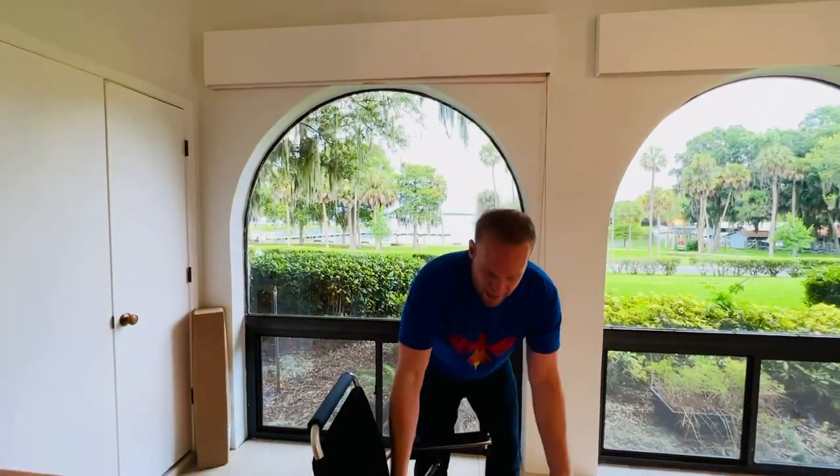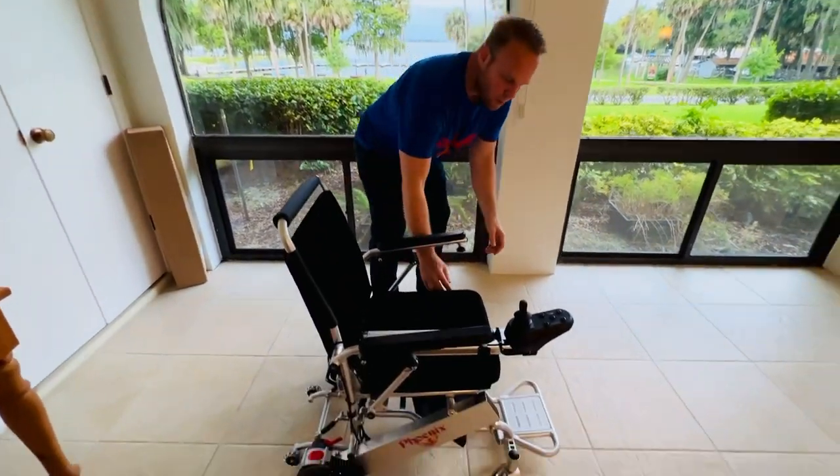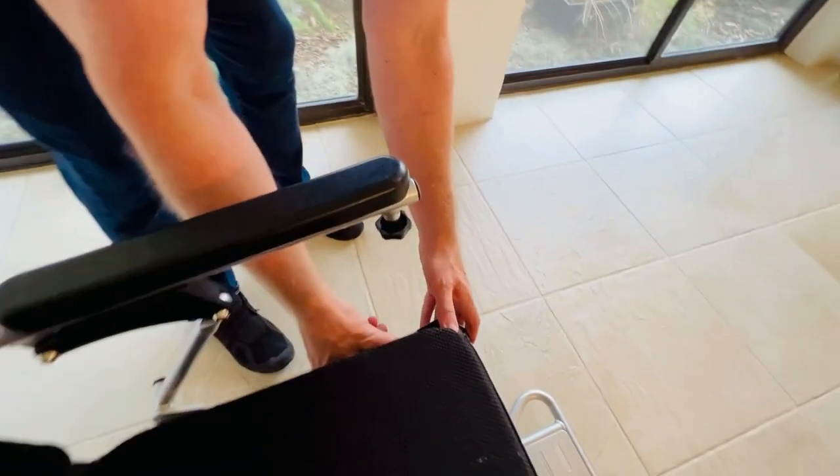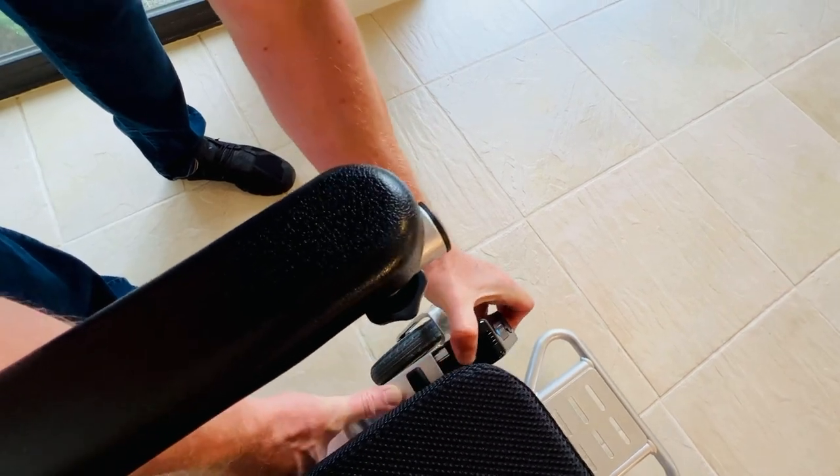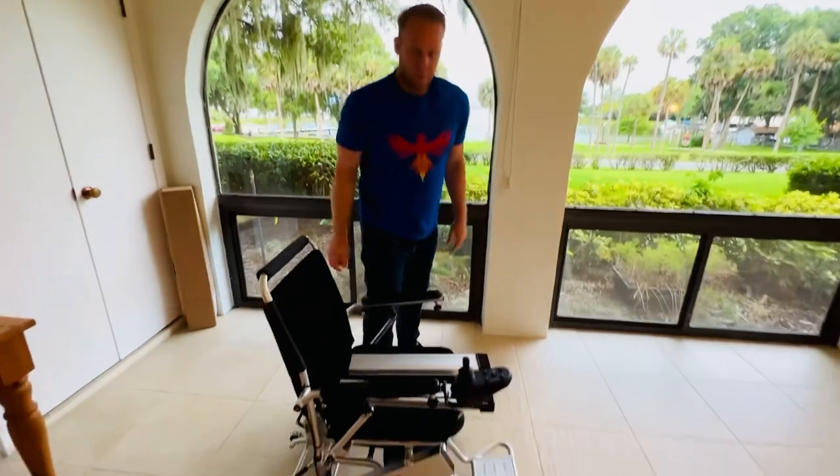These are FAA compliant non-spillable lithium ion batteries. And there is the button on the other side. I can just press the button and slide the other battery out. Very simple.